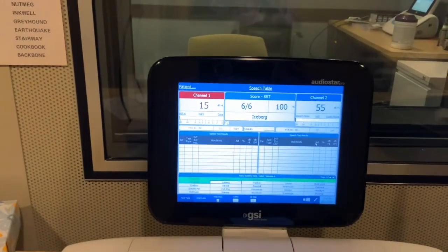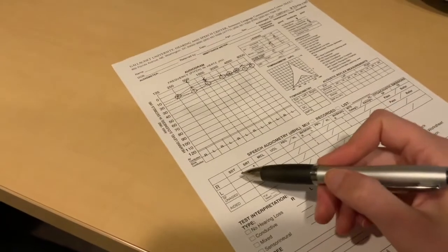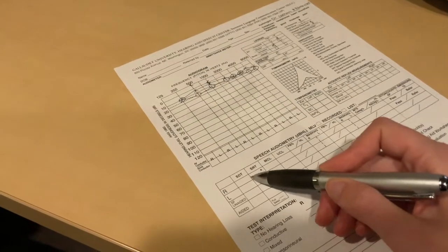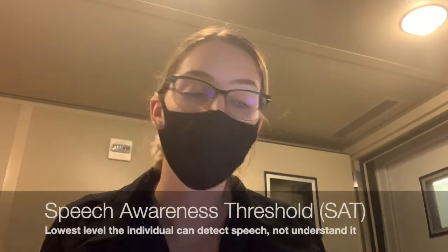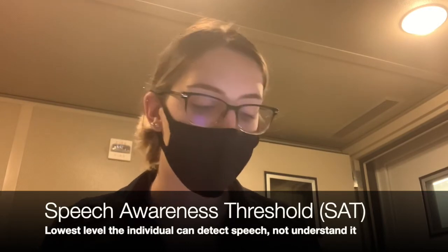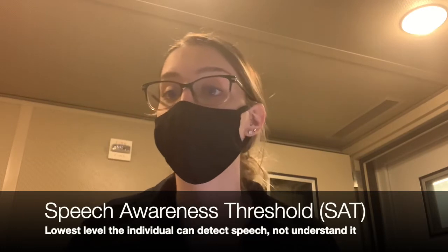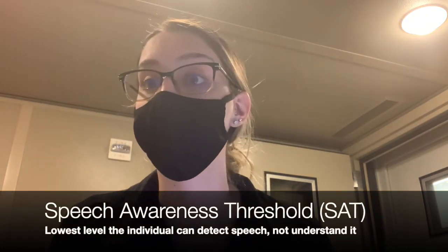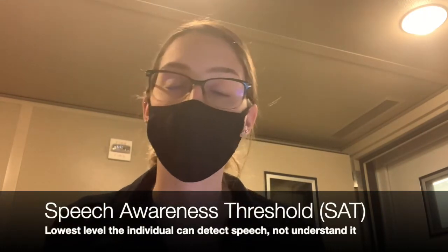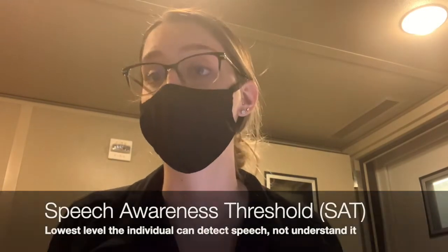So now that we have our 15 dB HL threshold, you're going to want to make sure that you write it into the correct place on the audiogram. Moving on, now we are going to find the speech awareness threshold, or SAT. This threshold is the softest level at which the individual is aware of the speech input being provided, so they do not need to have the correct response to it.